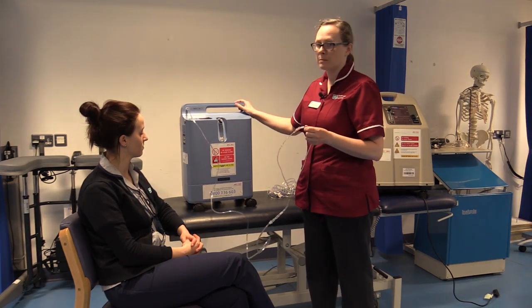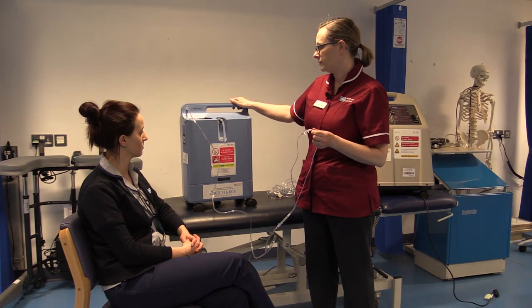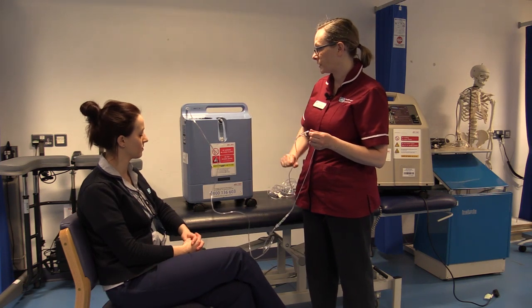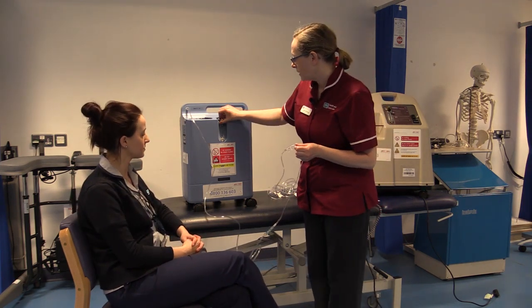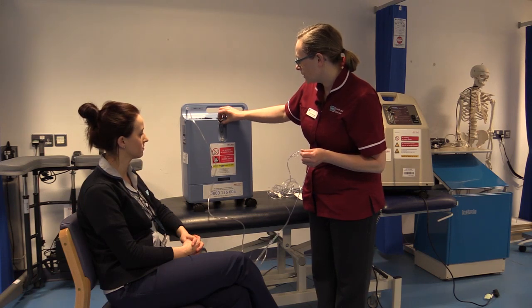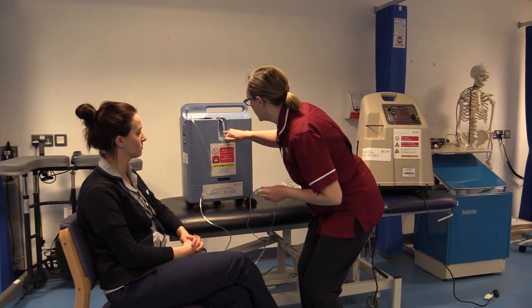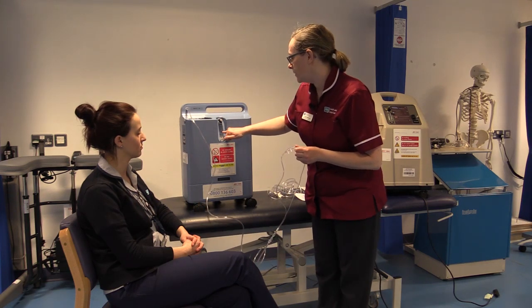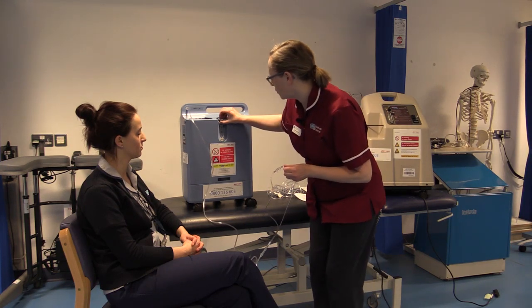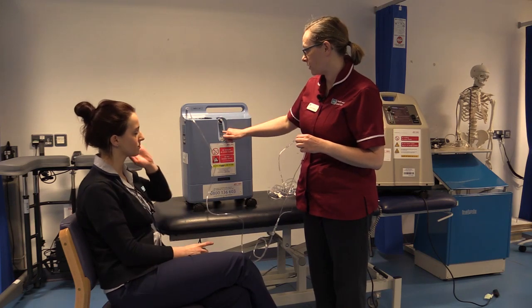So this patient is prescribed 2 litres of oxygen. So I'm going to turn the machine on. And you can see the alarm stopped and a green light is on to tell us it's functioning properly. It should already be set at 2 litres. You must, when this is on the floor, get down on your knees and be eye level. The middle of the line must be on the middle of the ball. So before you administer oxygen to the patient, you must ensure it's still set at the prescribed flow for this patient's 2 litres.